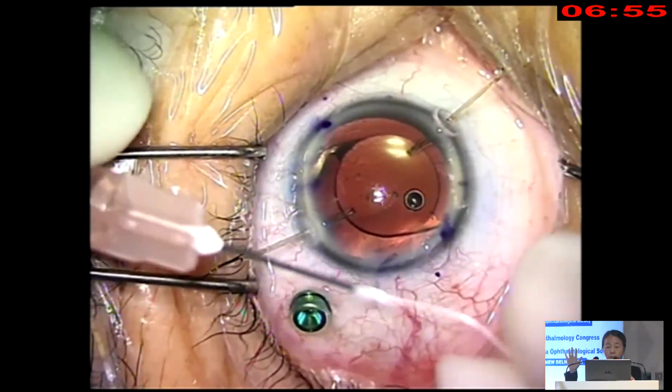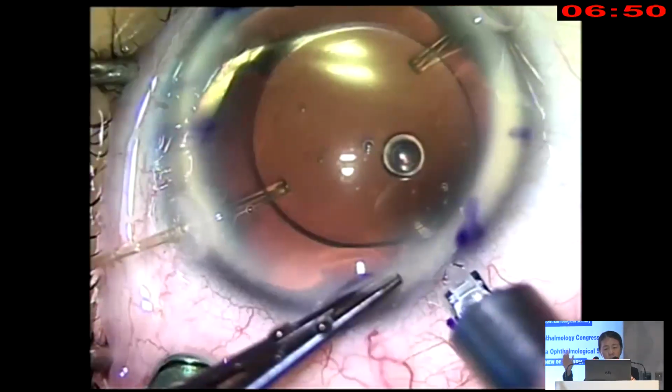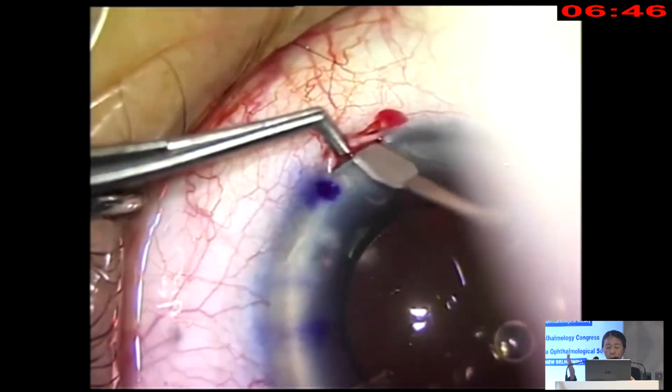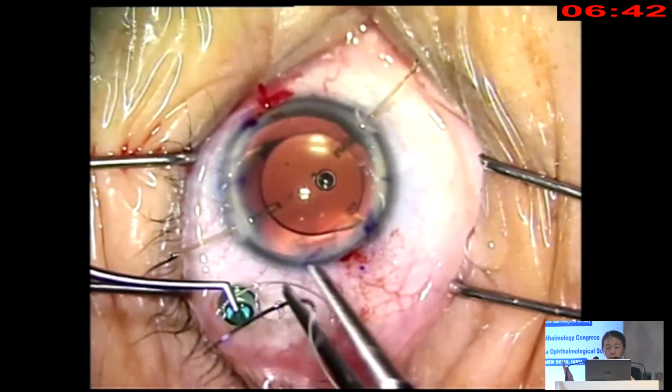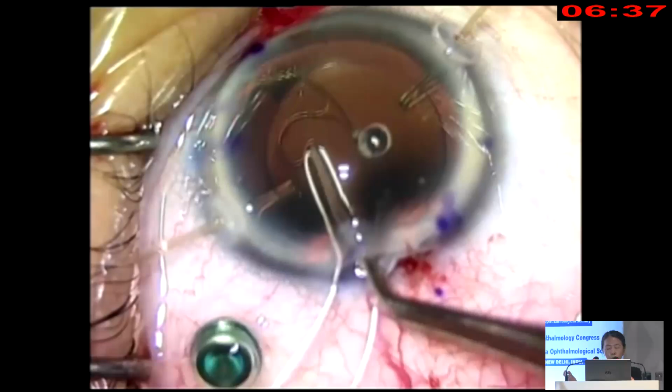Okay, if you don't seal the gap, you don't have the hooks, or you don't have your capsular bag centered, you will get fluid going behind. You can get fragments going behind, and you can get fluid pushing forward as well, and that's how you inadvertently catch the capsule.